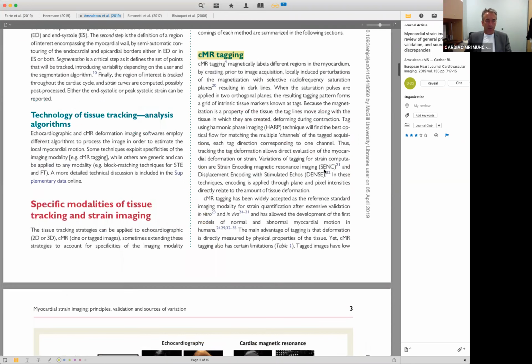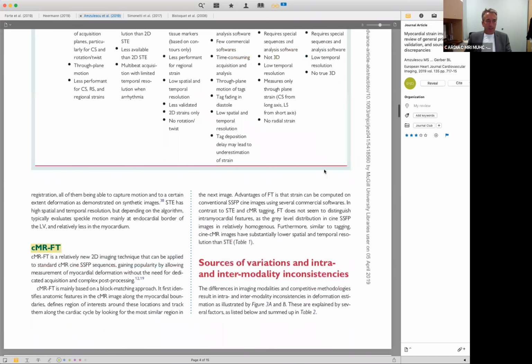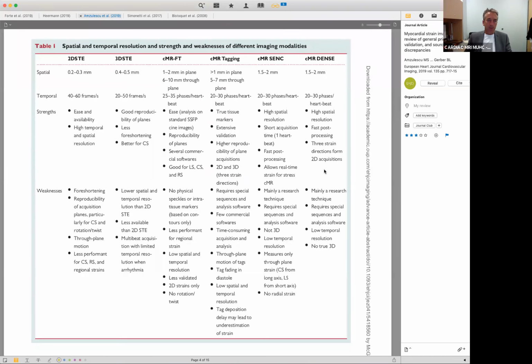Now in echocardiography, speckle tracking also has several limitations. In table 1, you can see that, and you can download the paper to go into more detail. It's a problem of positioning, because if you do not have the right plane, and in echo it's sometimes difficult to control for that, then your values are not necessarily accurate. It's also a problem of reproducibility. If you change your plane a little bit without really seeing that and without having that detailed control, you also may have issues.